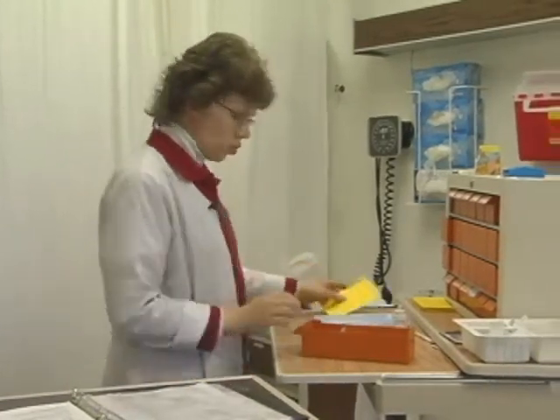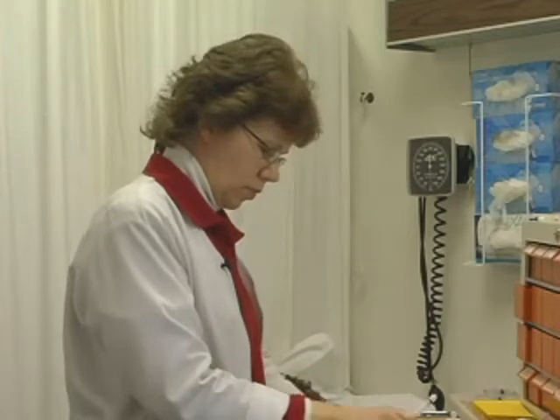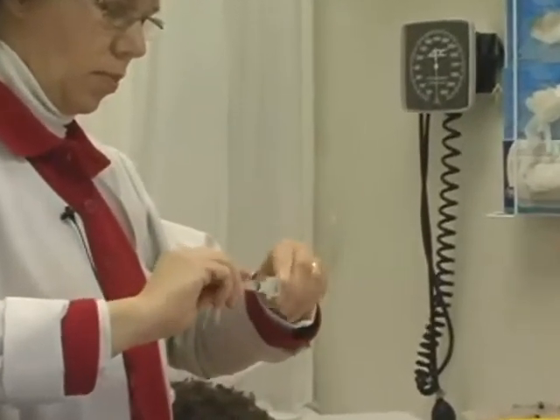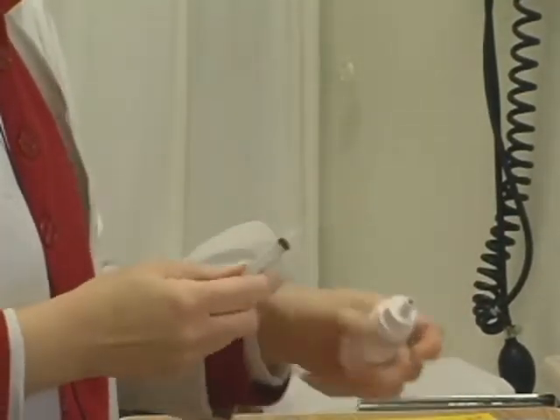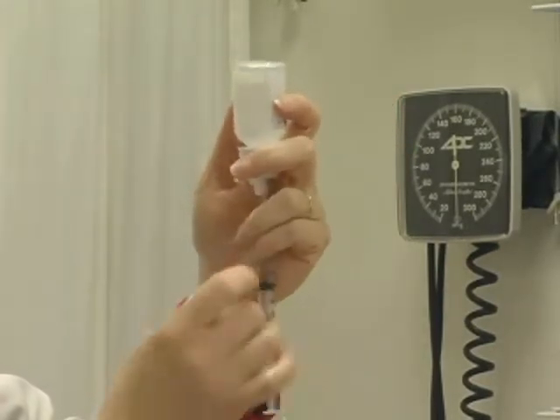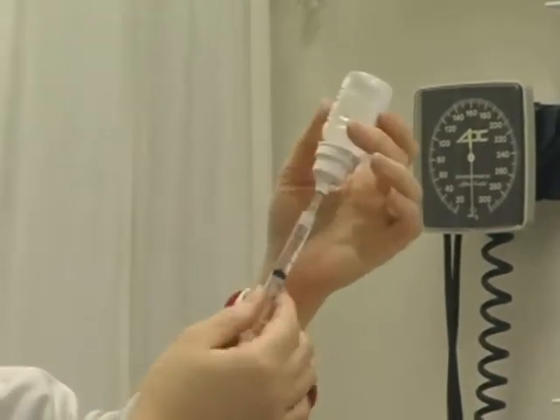Okay. So now with my calculation, I'm going to draw up my medication. So I need a syringe that's bigger than 2 mL, so I will choose a 3 mL syringe. And I'm going to put a needleless adapter on it. Cleanse the top of my vial. Inject my 2 mLs of air. And I have 2 mLs of medication.